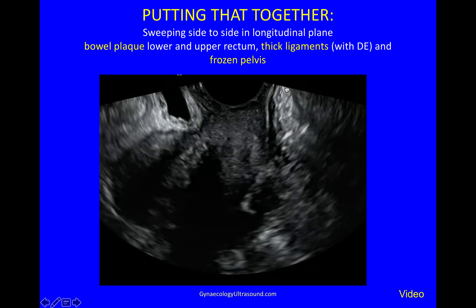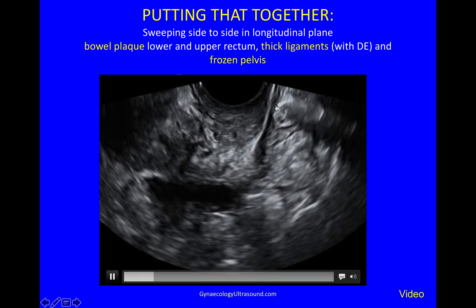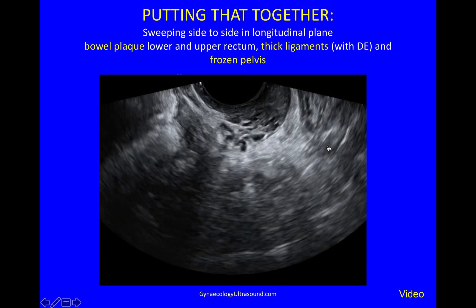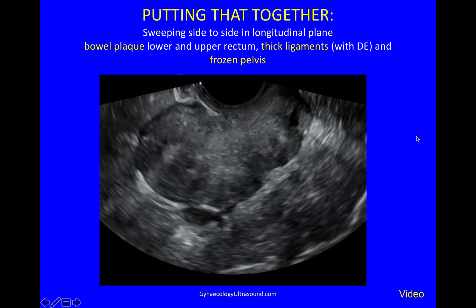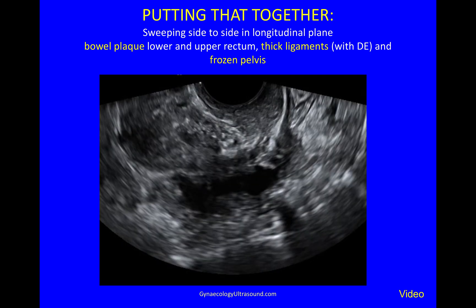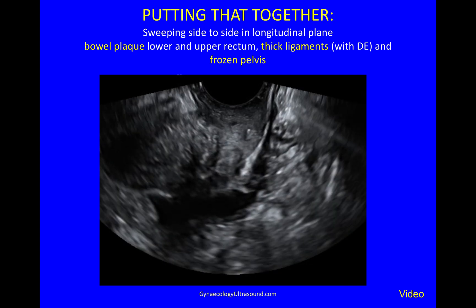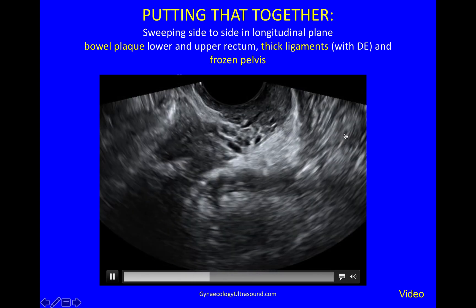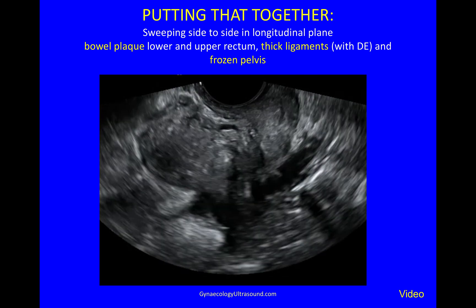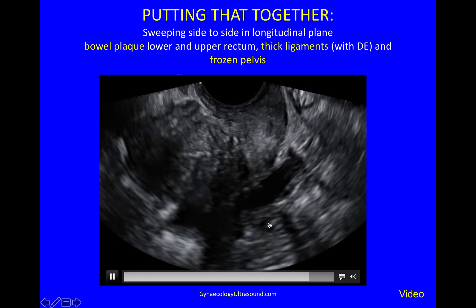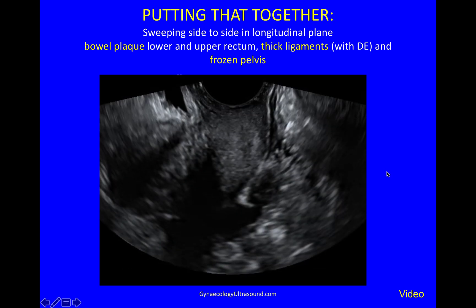If you put that together, staying in the longitudinal plane, sweeping from side to side, we're going to look at normal muscularis coming in there, then looking at this large bowel plaque attached to the back of the uterus, and thick ligaments with deep endometriosis. To do the sliding sign, you just very gently press in and out. It shouldn't hurt — you have to be very, very gentle. You can see nothing moved together at all; it all moves as a block. Now you can see the bowel plaque, and now the sliding sign — all of this moves together as a block. So this is a frozen pelvis.